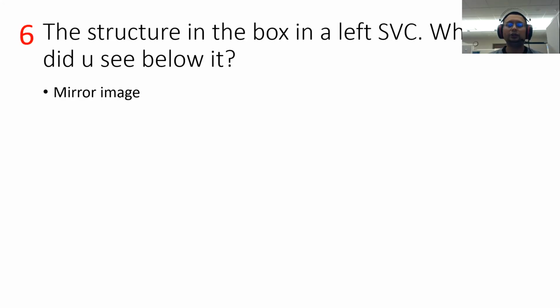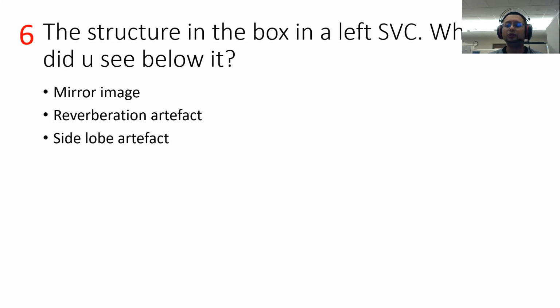Right. So that is a mirror image artifact. Reverberation, I've taught you. There is also another artifact that is difficult for me to explain logically, like the mirror image and reverberation. I can explain those to you logically, but for side lobe, I can only give you an example, okay?